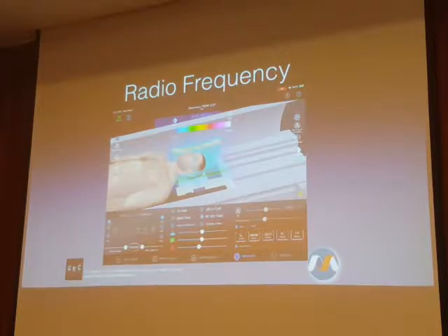So if I'm laying in your scanner and we're doing a head study on me, my arms, my upper arms or my shoulders are going to be against the wall of the bore if we don't put that recommended padding in between me and the bore. Which means if we're doing a head study, again, using the body coil for transmit, not a transmit-receive head coil, then the likelihood of producing a burn, this is where it's most likely to turn out.